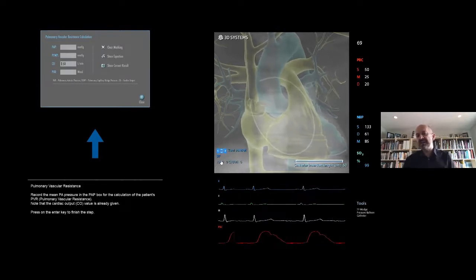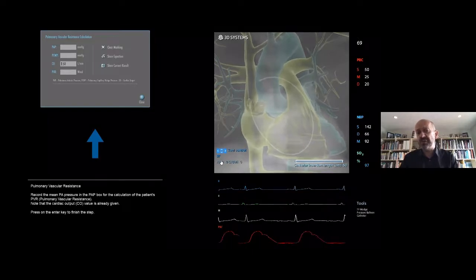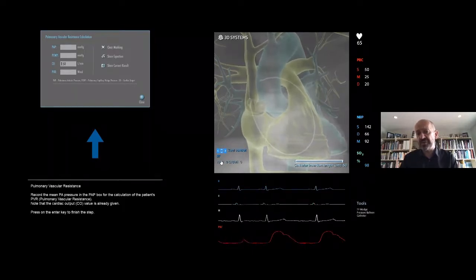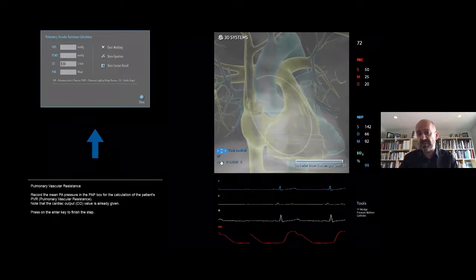So again, as I mentioned, this is a good example why you shouldn't be doing femoral PA catheters at the bedside. So please do them from above.